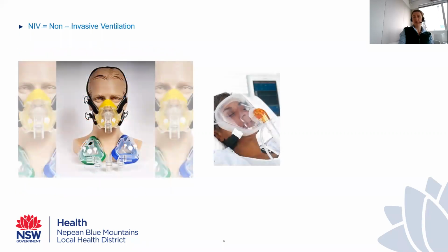So NIV, non-invasive ventilation, is what the words suggest. We are providing ventilation, so that's pressures, either an expiratory pressure plus or minus an inspiratory pressure, to the patient non-invasively, so via a face mask. That mask can be an oronasal mask, like the one you see on the left, or a full face mask, like the one that you see on the right.